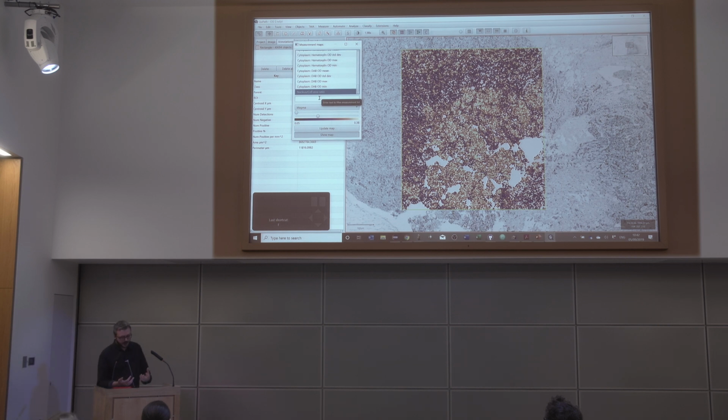So what we may want to do then is to train up a machine learning classifier, which we'll do in a moment. But we might want to give it a bit of extra information as well, because if you know the type of one cell, then very often the neighbors may be the same cell type, or at least it's relevant what the neighbors are.